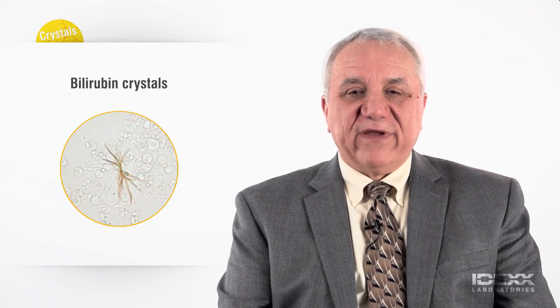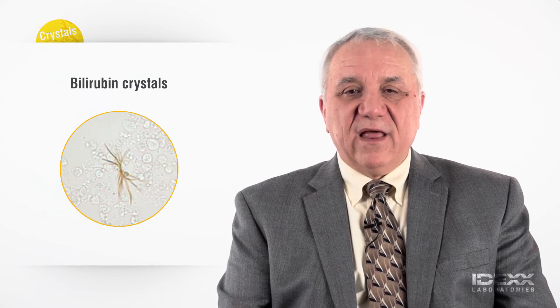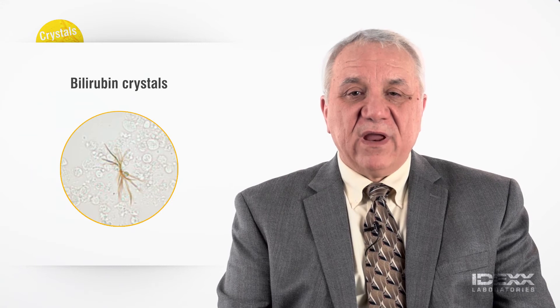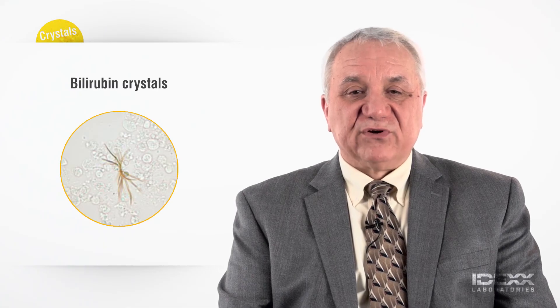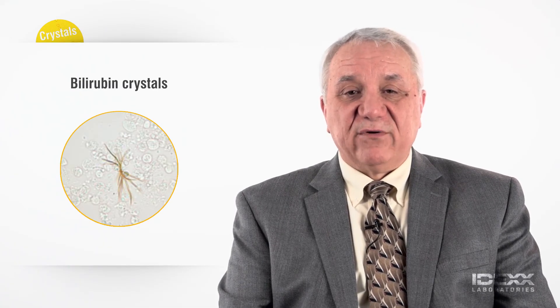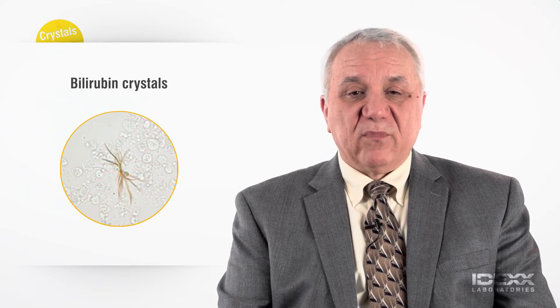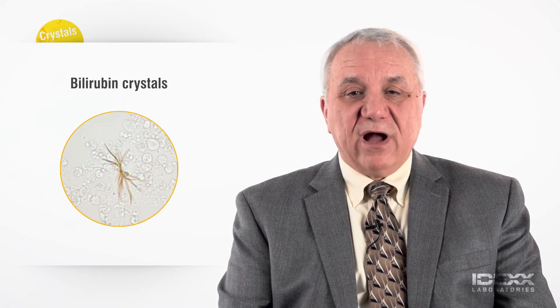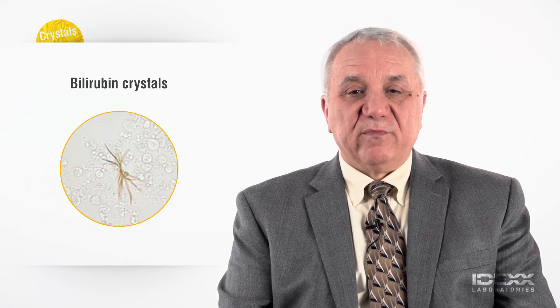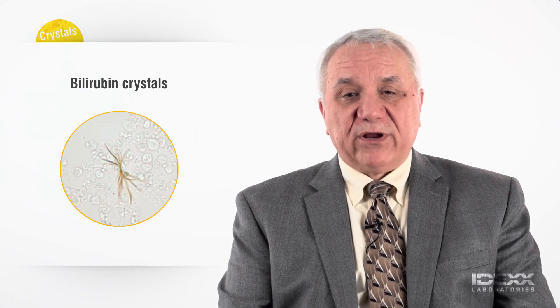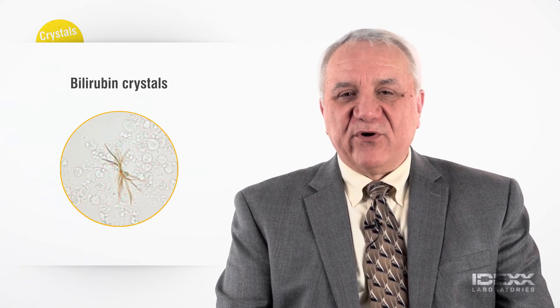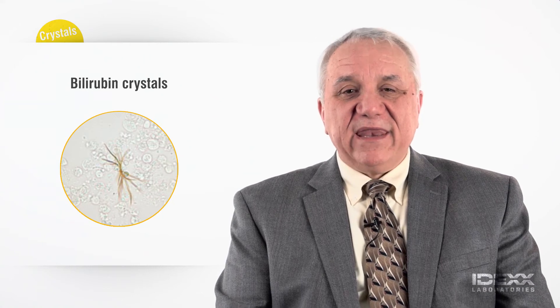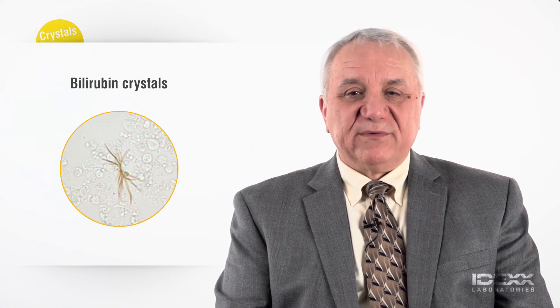Bilirubin crystals may form in the urine of animals in typically acidic urine specimens. The crystals are needle-like and yellow-red to reddish-brown and relatively easily identified. In highly concentrated urine from dogs, bilirubin crystals may be formed because bilirubin is normally found in dog urine. If present in large numbers repeatedly, especially in mildly concentrated urine specimens, increased conjugated bilirubin excretion associated with abnormalities in bilirubin metabolism, primarily cholestasis, should be suspected. These cases should also have detectable bilirubin on the chemistry dry reagent strip. In the example on the previous slide, there are many leukocytes and bacteria in the background.